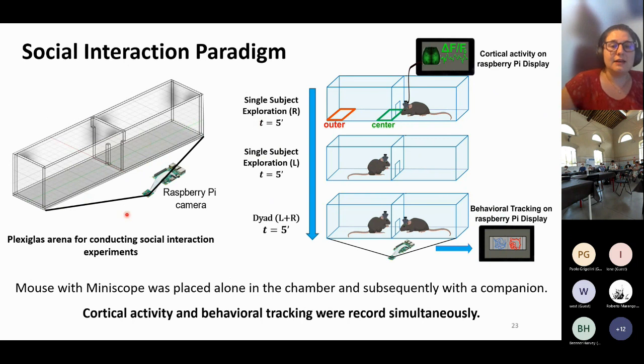In our study, we investigate the social interaction between mice in a custom-made environment. In detail, this arena is composed of two chambers separated by a transparent wall with a fissure located in the center to allow the mice to interact with the nose.